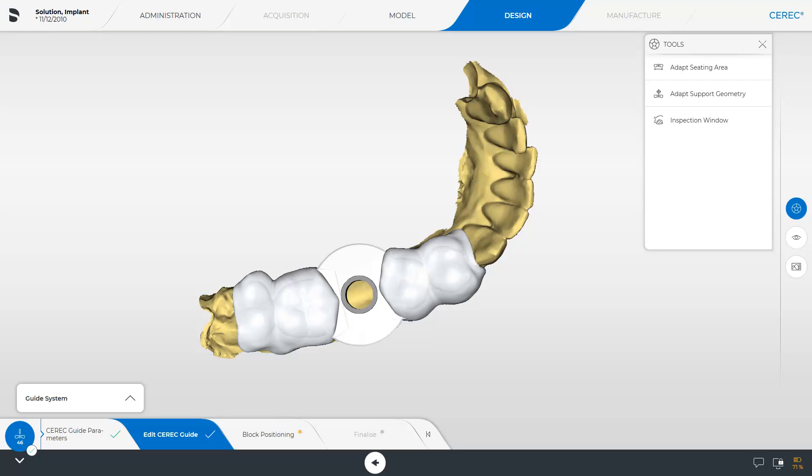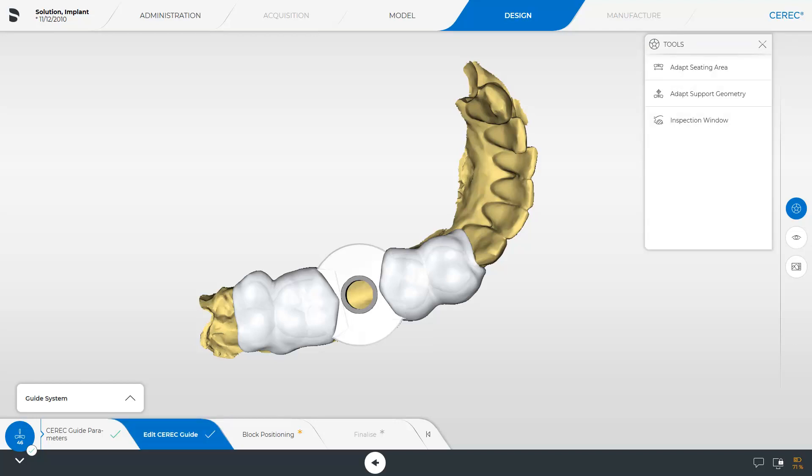The surgical guide includes two adjacent teeth, mesial and distal respectively, if present. In the Edit CEREC Guide step, you have three tools at your disposal. First, we take a look at the proposal.